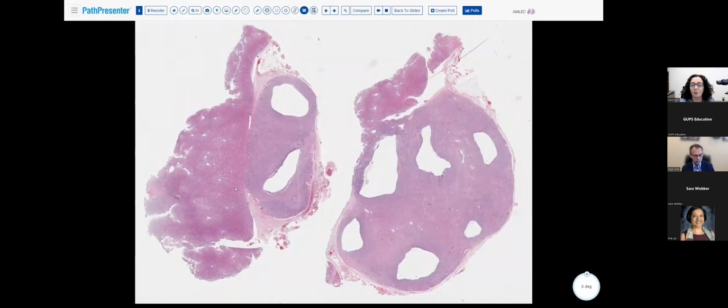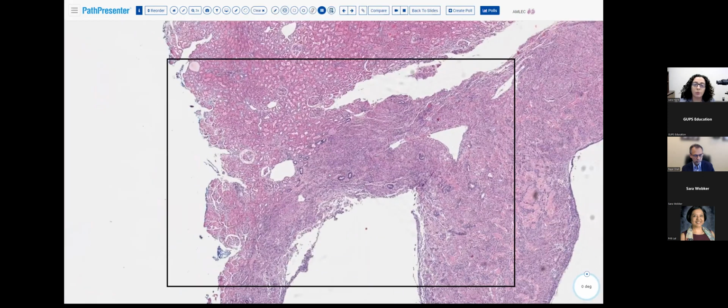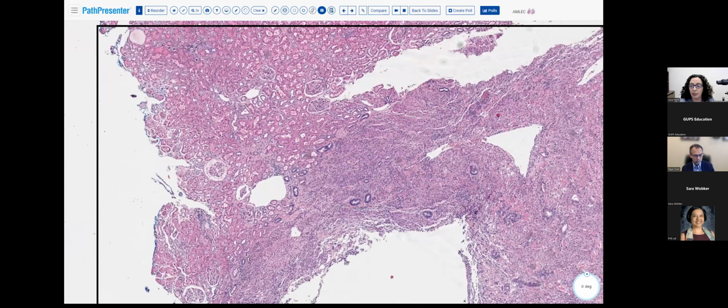And that's when we got it in pathology. The specimen showed a well-defined lesion that seemed to abut the renal parenchyma in some areas, but in other areas seemed to intermingle with the renal parenchyma, with some of the renal tubules infiltrating superficially into this nodule.